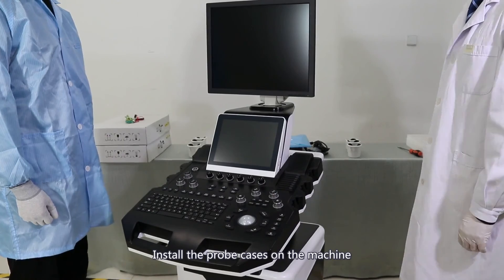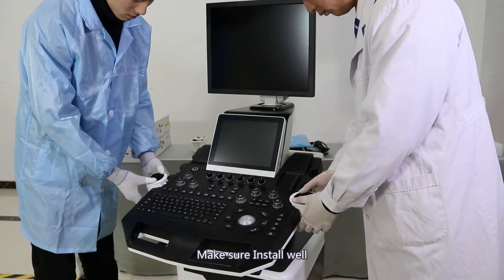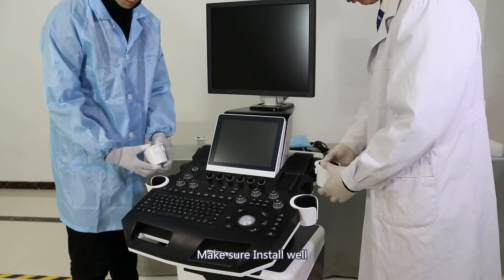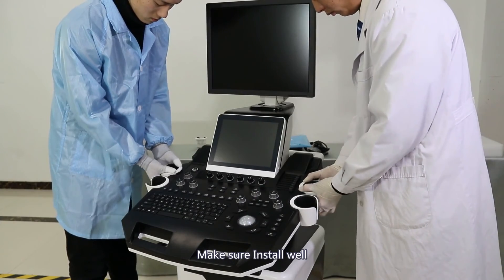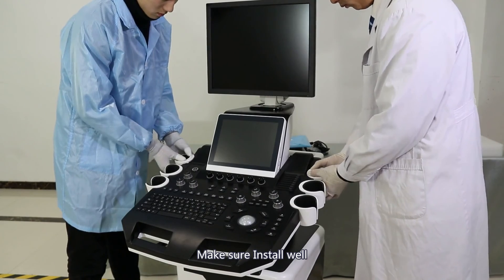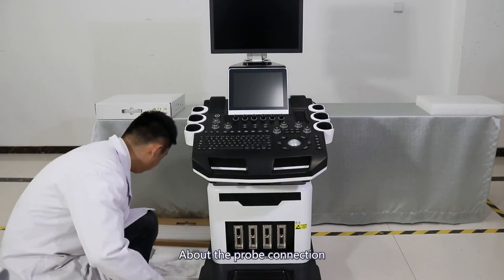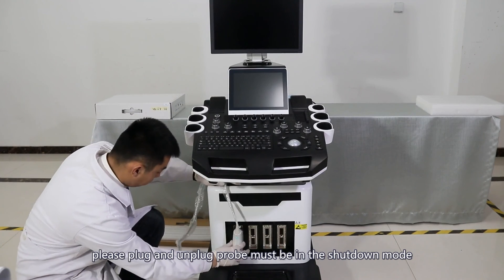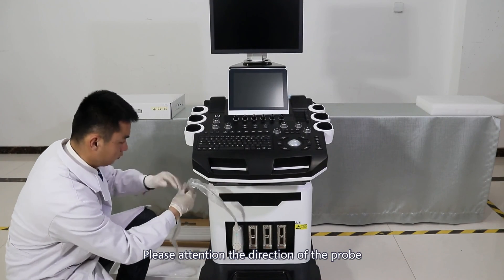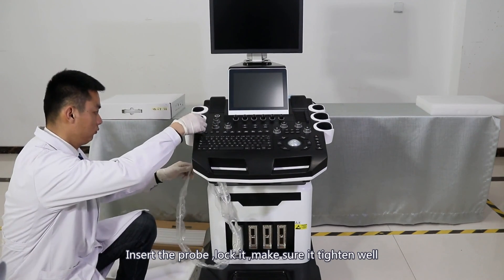Install the probe cases on the machine, making sure they are installed securely. About the probe connection: plugging and unplugging the probe must be done in shutdown mode. Pay attention to the direction of the probe. Insert the probe, lock it, and make sure it is tightened securely.